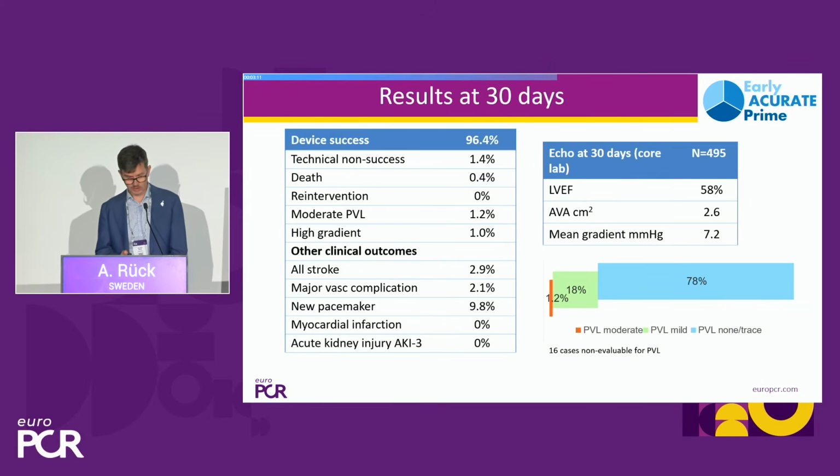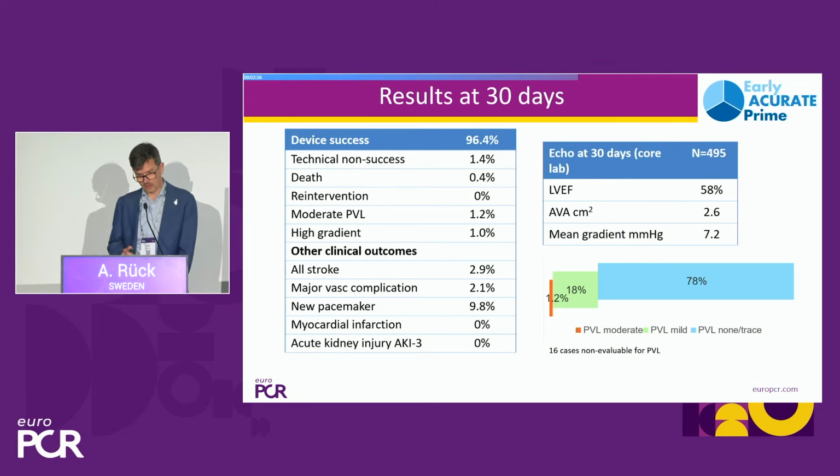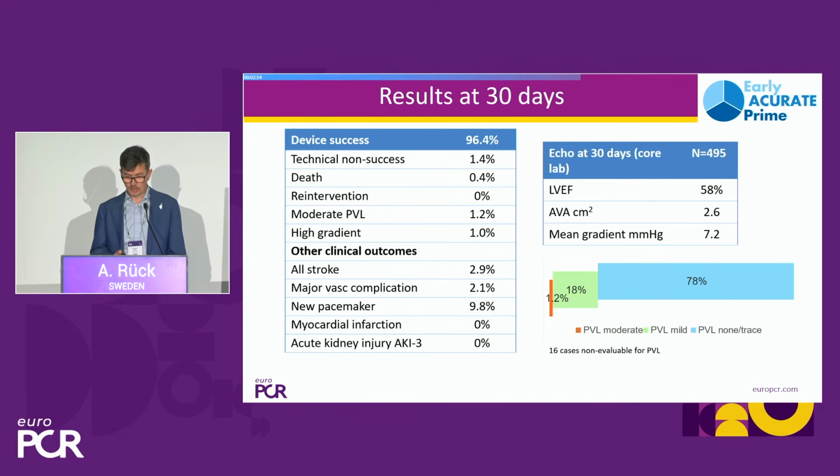Clinical outcomes, 2.9% major stroke, or all stroke, sorry, at 30 days. Major vascular complication, 2.1%, and new pacemaker rate just short of 10%, 9.8%. No myocardial infarctions and no acute kidney injuries, grade 3.